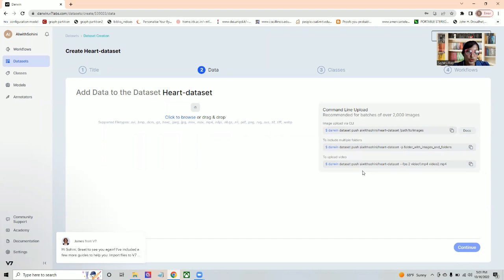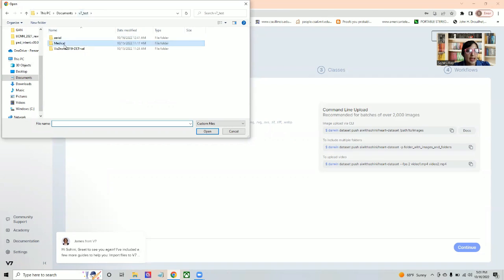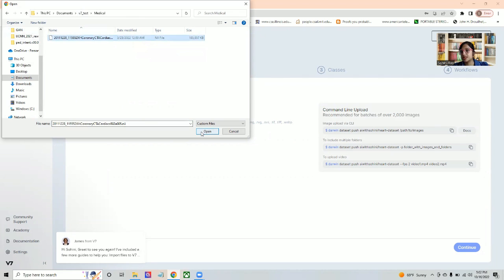In this case, I am just going to be browsing. I already have an NII file, which is heart MRI. I'm going to be putting the link to all of the datasets that I'm going to use on the description box below. So I have created this new dataset.